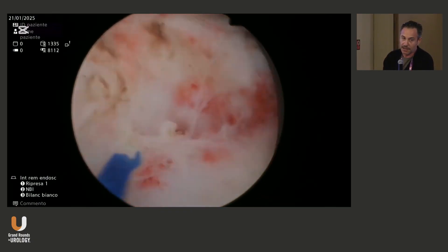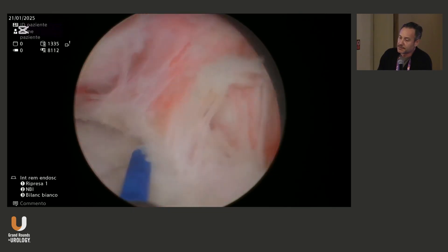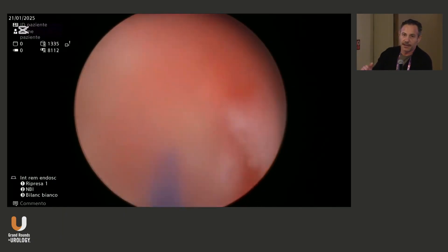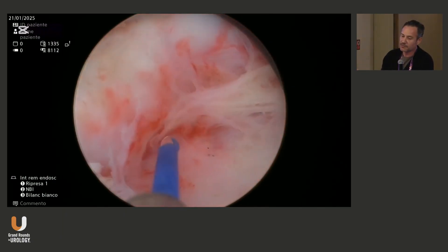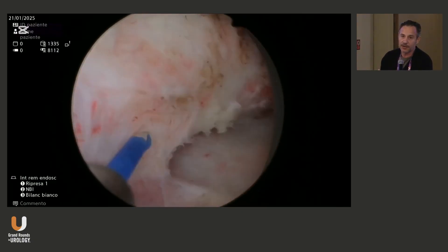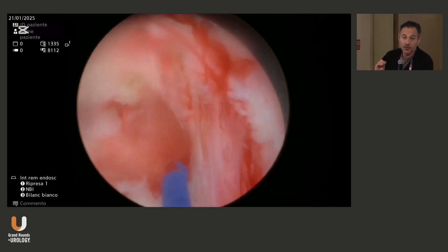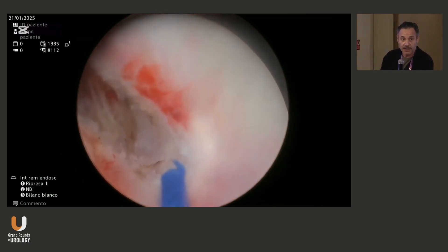I go on both sides — on the right side and on the left side. This is almost the entire procedure in about 10 minutes; I will show you the whole left lobe and about 80% of the right lobe. If you go slowly and control exactly all the bleeding you encounter, you're going to have a clear operating field, which is crucial for this kind of technique — not only for the enucleation part, but also for the morcellation.